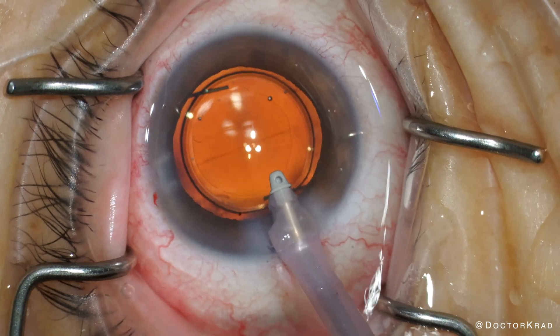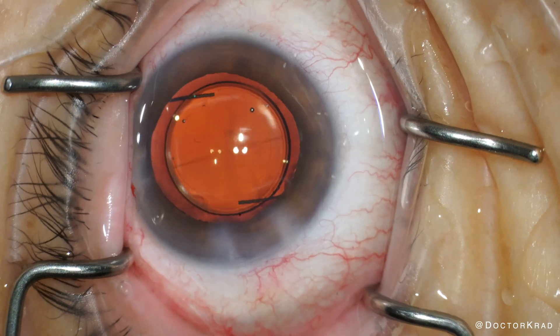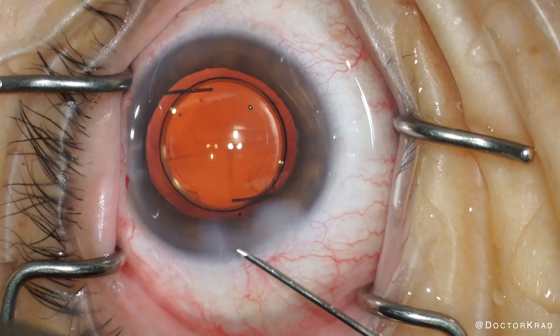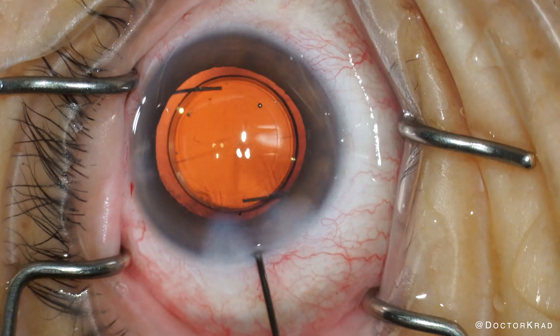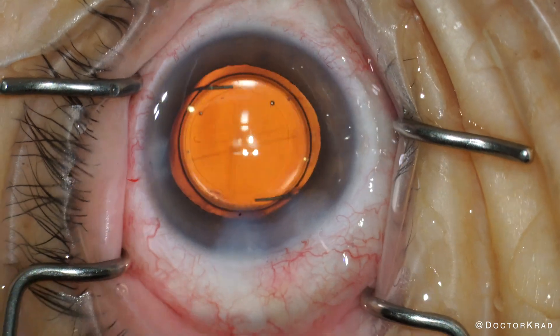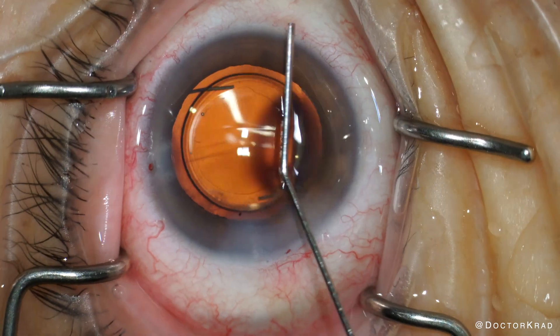So that wasn't the main problem I had with the injector. Even if I needed to make the incision bigger — right now it's 2.75 millimeters, even if it had to be 3 millimeters — I would rather the lens come out more planar and flat and not dive so deep into the eye. I would have loved that upgrade. But I'm sure they are working on it. The team at RX Sight are brilliant, and hopefully on the next version the lens will come out in a planar way.